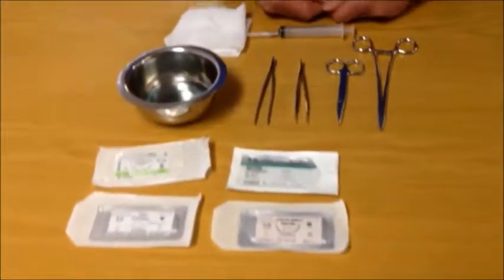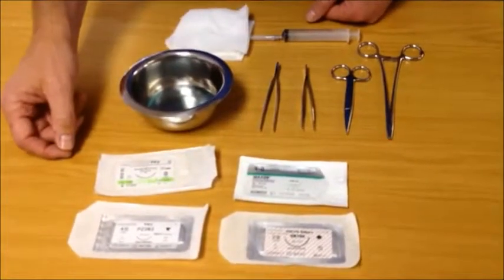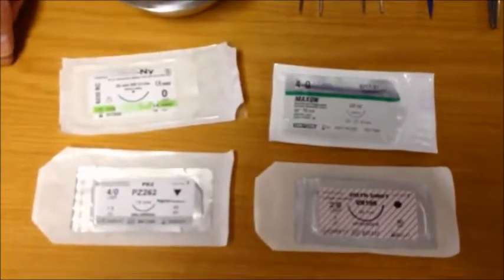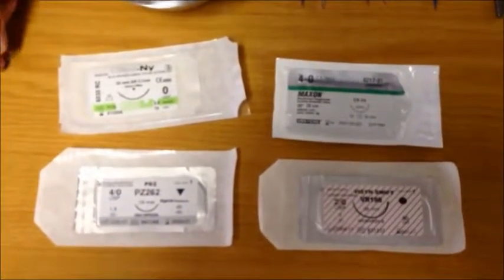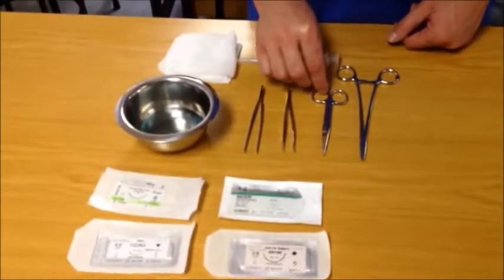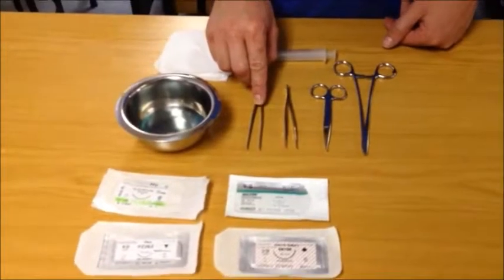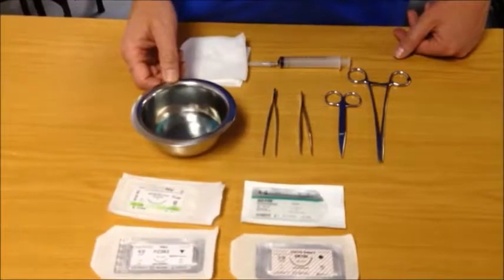First, let's talk about the equipment that is required. The minimum equipment you will need to suture a wound is suture material. There are many different kinds of suture material available on the market and a full discussion of their pros and cons are outside the scope of this demonstration. Today we will use a nylon monofilament suture. You will also need a needle holder, a pair of scissors and either toothed or non-toothed forceps depending on what's available. You will need local anesthetic to anesthetize the wound, some gauze and a cleaning solution.